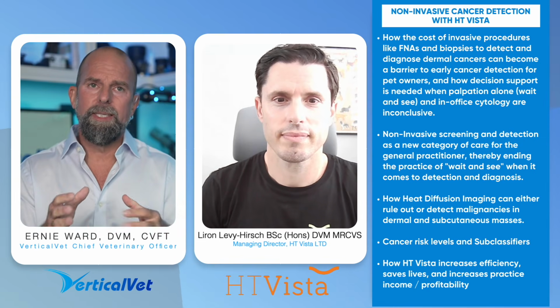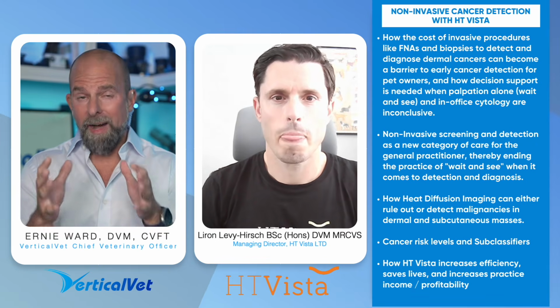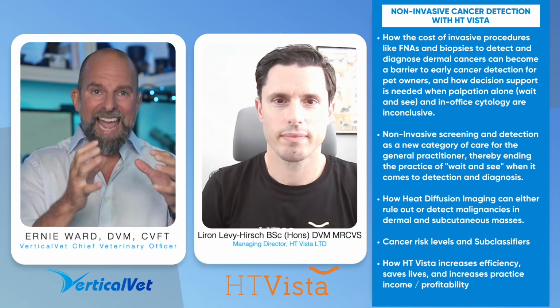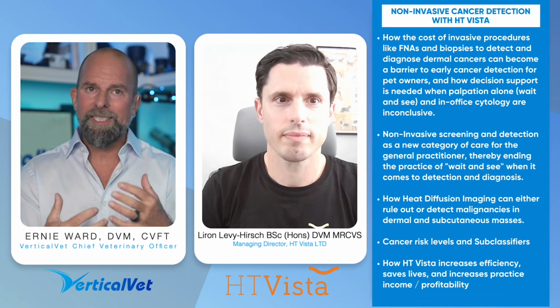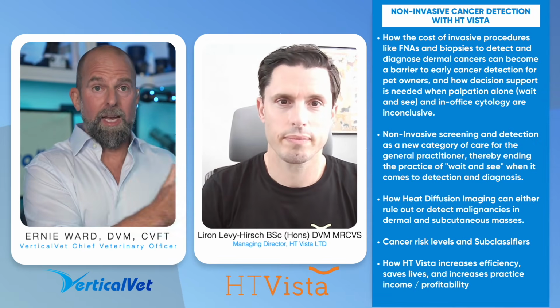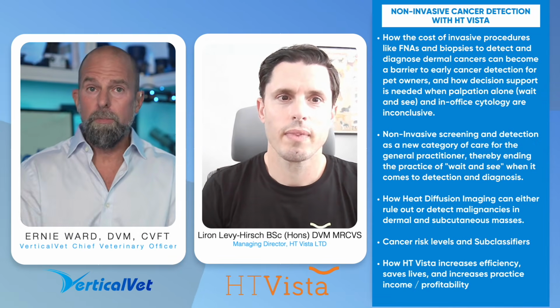I do want to also speak to some of these subclassifications, because what has happened in my experience with HT Vista over the past year or so is you guys are getting more and more refined in the process. So now we've got these subclassifiers. So maybe explain to the Vertical Vet family what that means. I mean, now it's not just more than likely benign versus malignant, but you guys are going to level deeper, just like they are in human medicine. Yeah, absolutely. The subclassifiers came from the fact that we've managed to collect loads of data over the last couple of years, from oncologists that we work with or GPs that contribute and want to be part of this community of helping the algorithm become better.